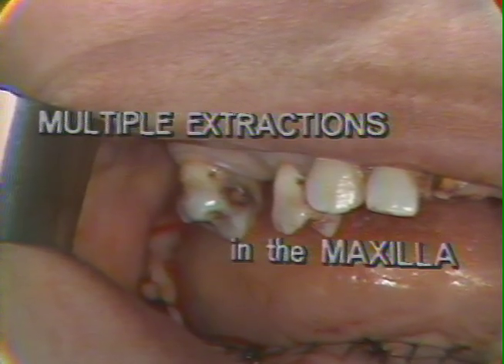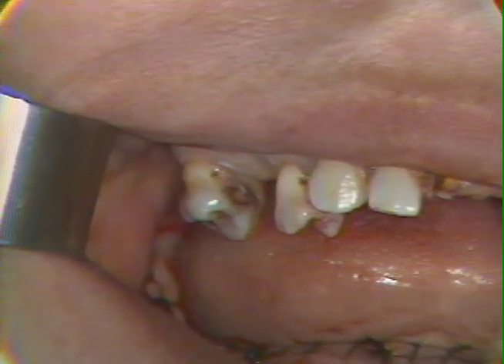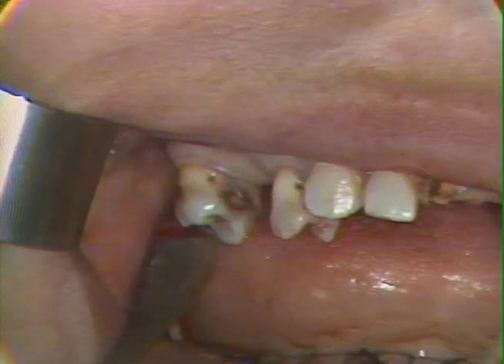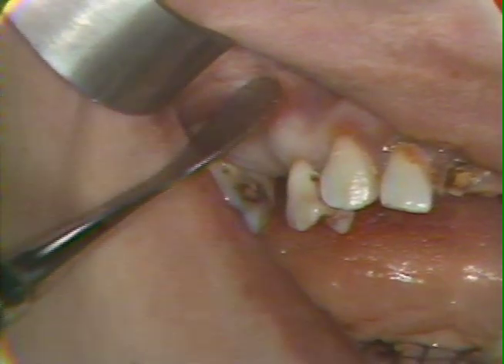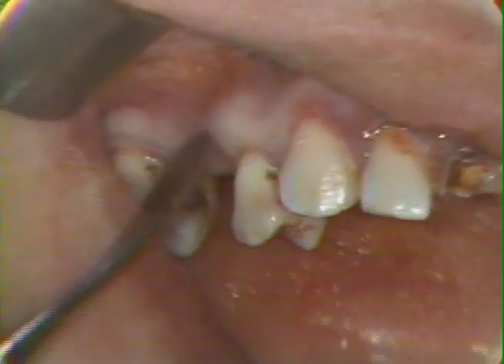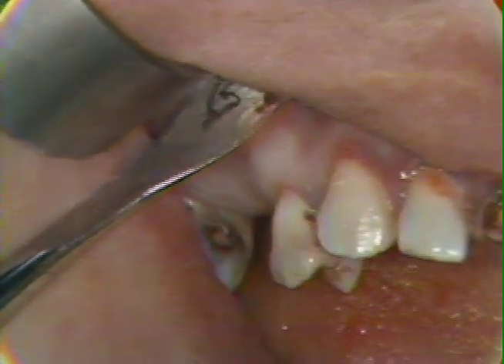The patient's position has been modified to tip her back. The area has been anesthetized, and we now will proceed with the removal of these remaining maxillary teeth. They include the molar, these bicuspids, and the anteriors. While we're looking at them, you can see that the bone contour is quite variable. Here, around this remaining very solid bicuspid, is a roll of bone with an undercut above it.